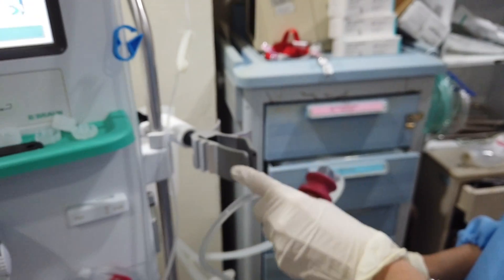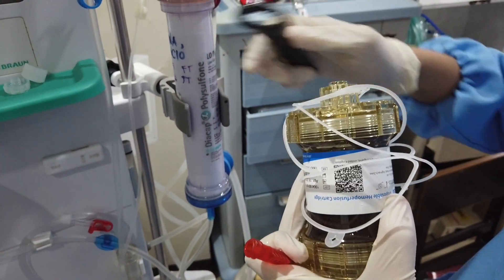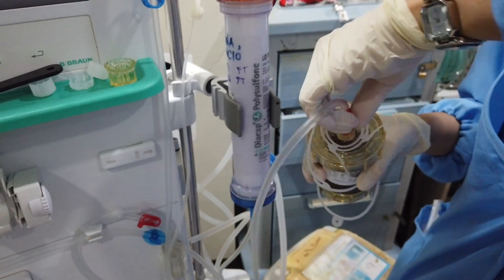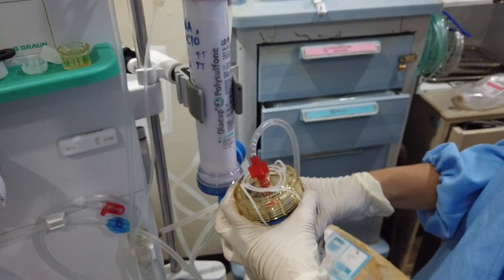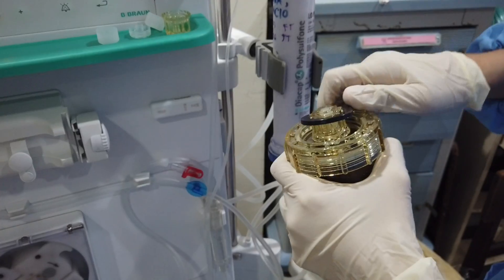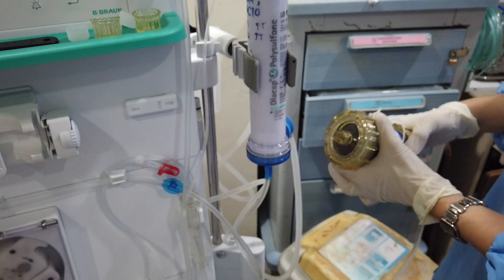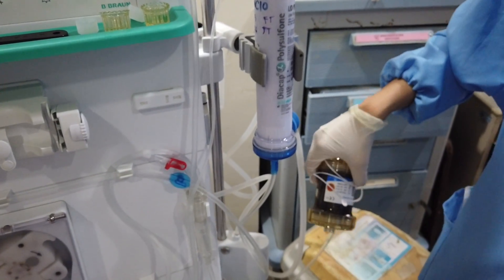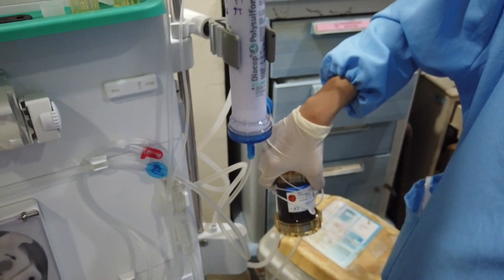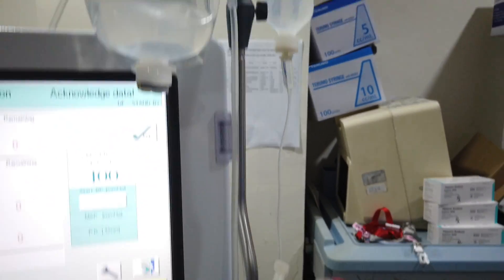Remove the arterial end line from the dialyzer. Using the opener, open the cap of the bottom of the cartridge. Hook the arterial end line to the bottom of the cartridge. Open the other cap. Before starting the blood pump, drain the arterial end first. Then start the blood pump. Now you are rinsing it with D5 water.